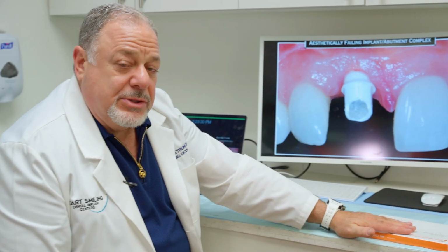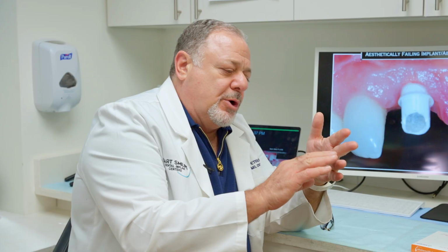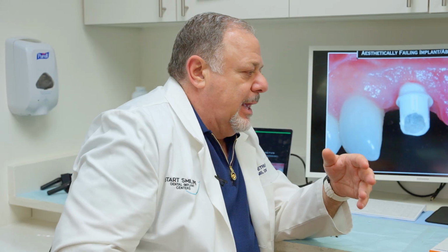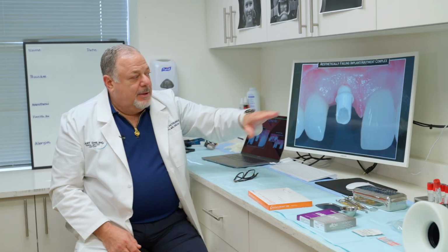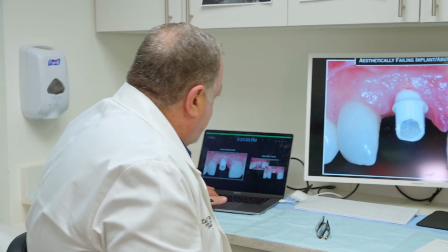We have our dermis out, okay, that we're going to be using because I'm anticipating doing not only bone replacement, but also tissue replacement on the facial of the implant itself at this stage, okay? And so we're prepared for all of this to happen in addition to maybe not getting the implant out and maybe having to graft first. So there's a lot of flexibility at this point, although I'm going to really do the best I can to try to replace the implant simultaneously with the removal procedure, okay?